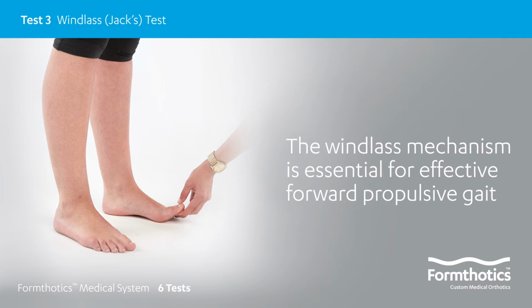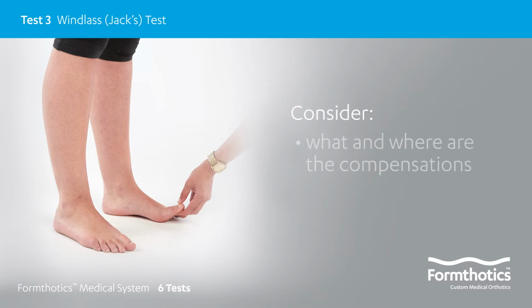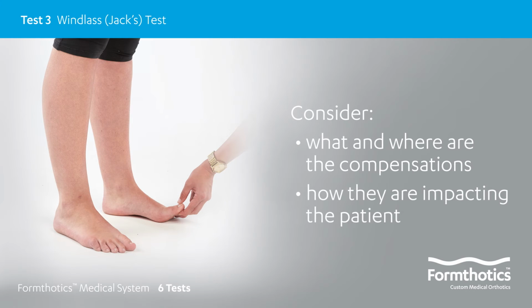A thorough and detailed understanding of the gait cycle is important for the clinician to see why the patient is unable to move efficiently forward without compensation. Consider what and where the compensations are and how they are impacting the patient. This helps the clinician decide a management plan that assists the patient to move more effectively forward during gait.